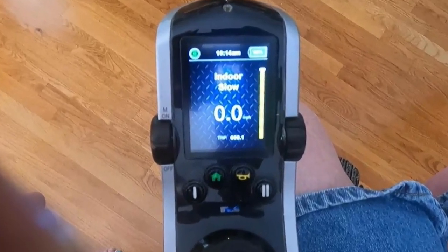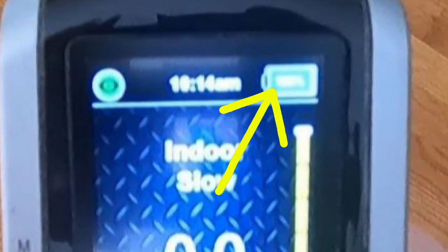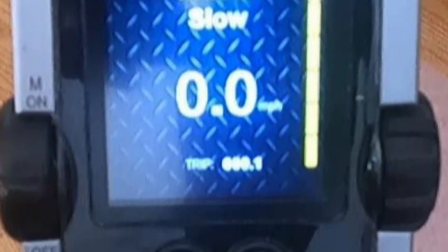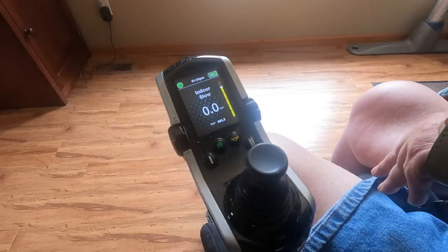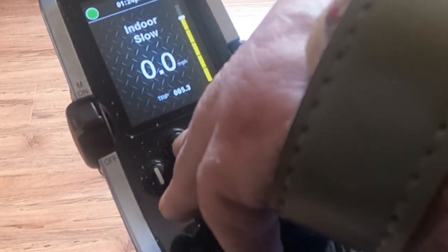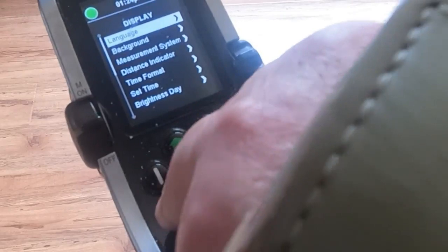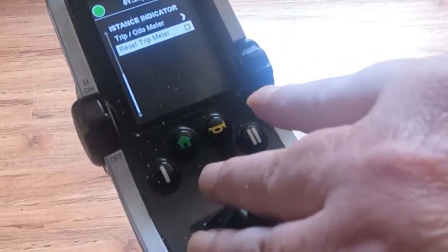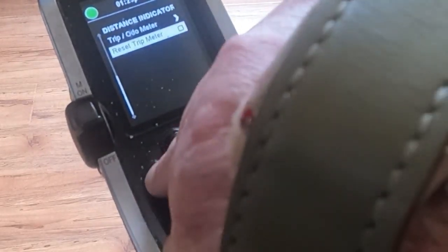Your drive screen not only tells you the condition of your battery charge, but also has an odometer and trip meter to indicate your mileage. The selection between the odometer and trip meter can be made, as I'll explain in a bit. When reset to 0 after a fresh recharge of batteries, I can get some idea of how far I've driven on each battery charge. If you would normally just putter around the house, like I do, you'll use more battery using the seat functions, especially the seat elevator, than you will amassing miles with the drive system.